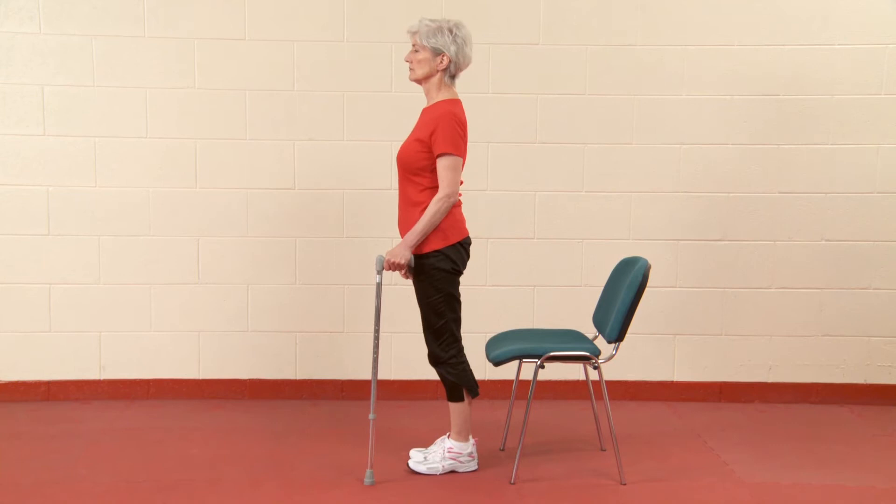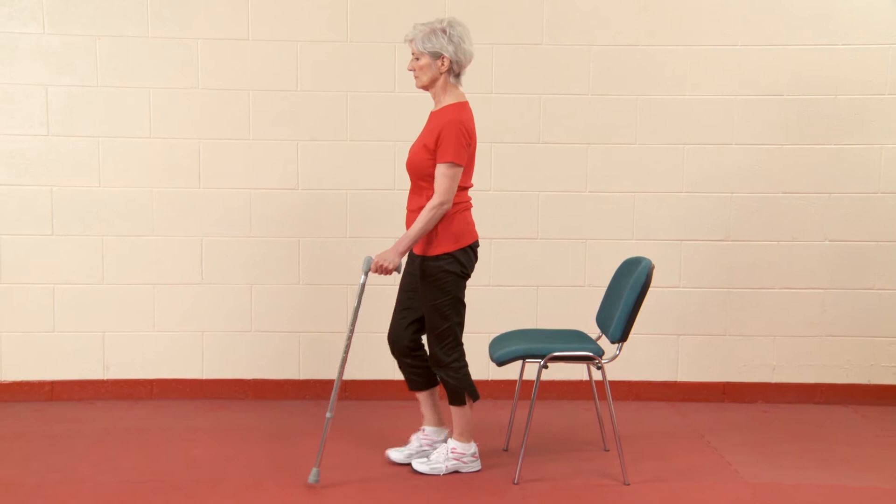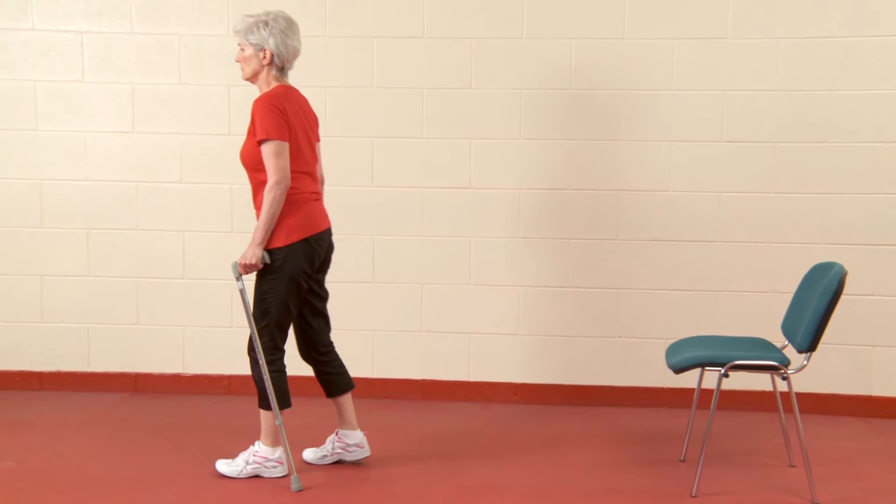Move the walking stick and step forward with your bad leg. Take a step with the other leg past the walking stick. Do not twist or swivel on either leg.